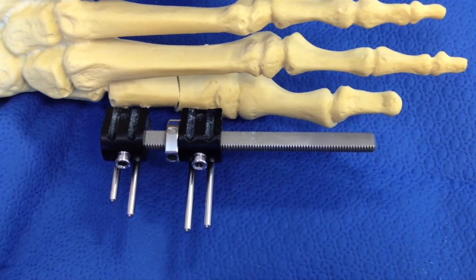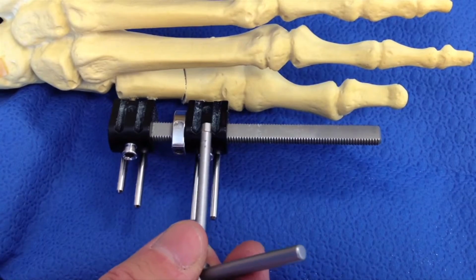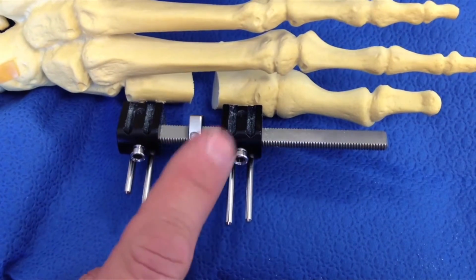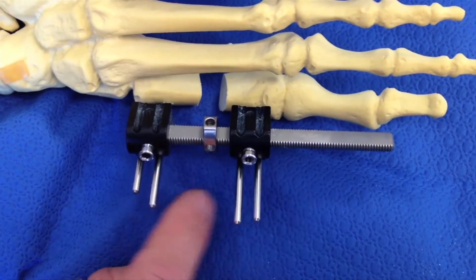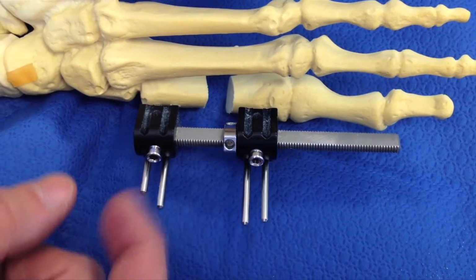I'd like to show you how the rail works. Basically, this nut pushes this carriage down this way, like that. So the nut needs to spin along the rail in order to push the carriage. So we need to turn the nut in this direction, which is clockwise.